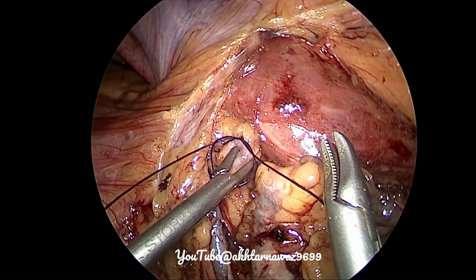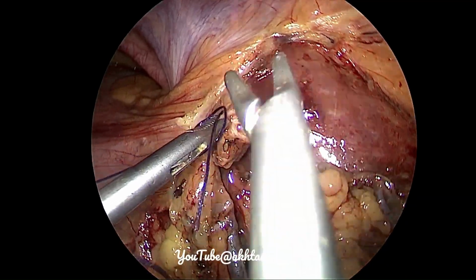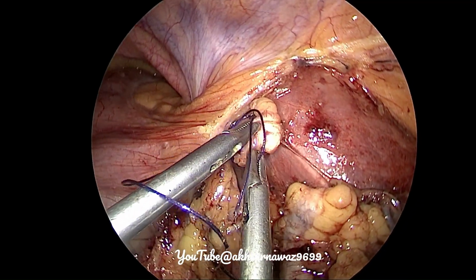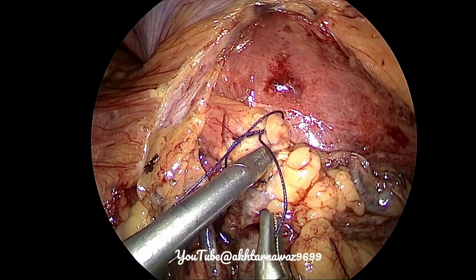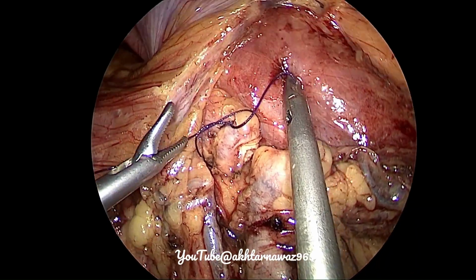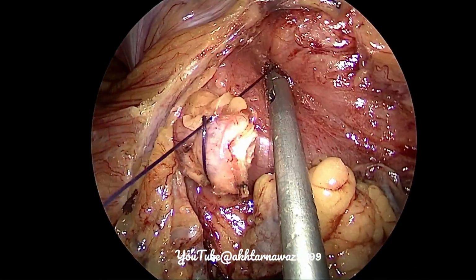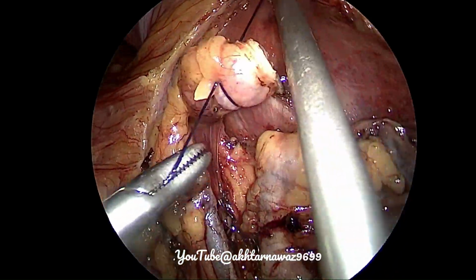However, theoretically, cases have been reported, and theoretically there is a chance that this end of the ureter may start bleeding later on, leading to hematoma, or in case of reflux, that can lead to contamination of the peritoneum with the urine.